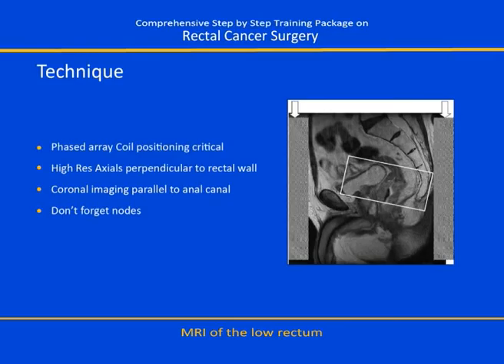That's what we observe. And so this is the next series, which, as you've pointed out, Bill, has to be angled differently because the angle between the rectal wall and the anal canal is somewhere between 90 degrees and 110 degrees, something like that.